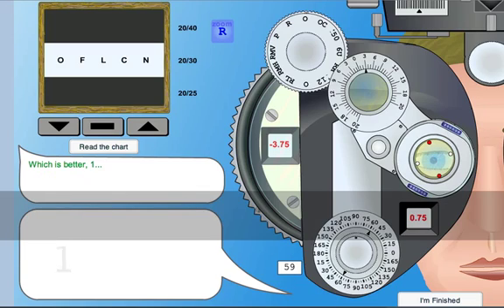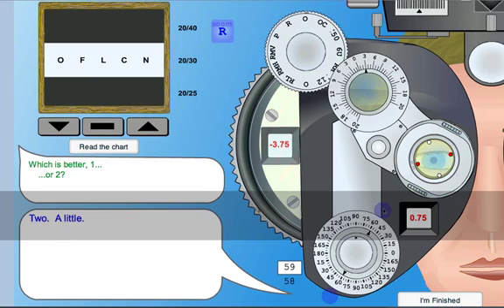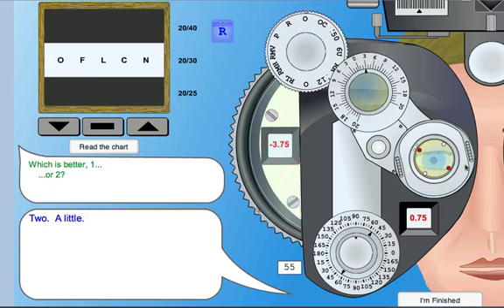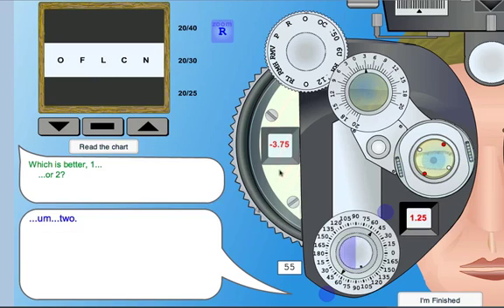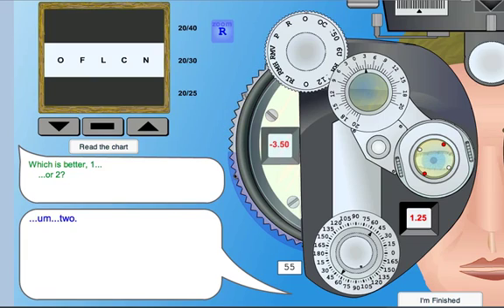Which one's better, 1 or 2? 2 a little bit. And then we can do some searching, looking at the cylinder power. Which one's better, 1 or 2? They like 2, so we'll add a little bit more minus. And basically just continue on from there.